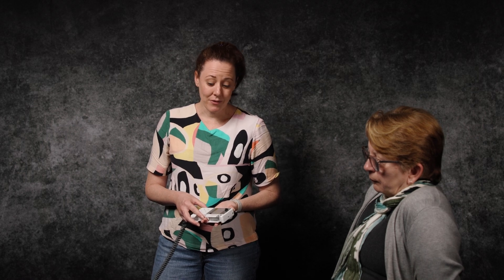The next task I'll demonstrate is taking a toe systolic blood pressure. Toe pressures are incredibly useful to identify arterial disease in the lower limb. They're particularly useful in people with diabetes, in older people, and also in people with renal failure.